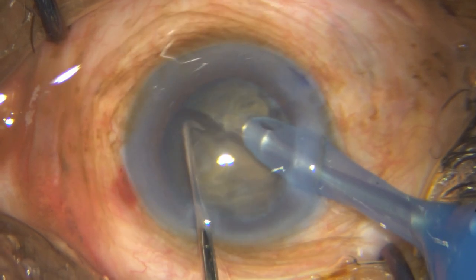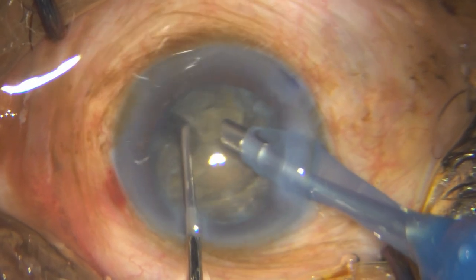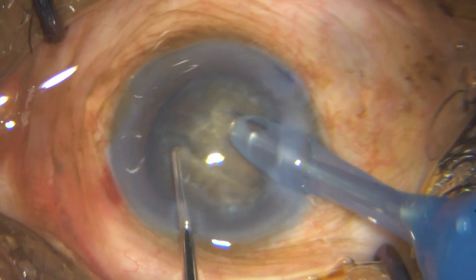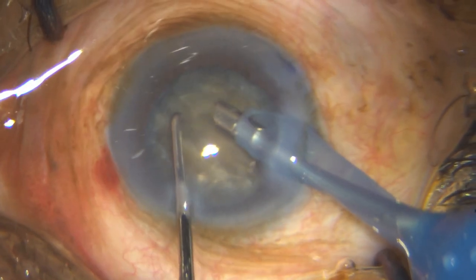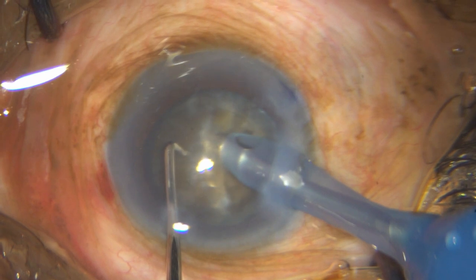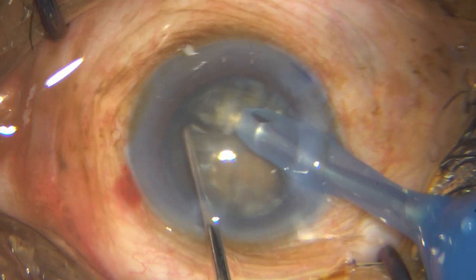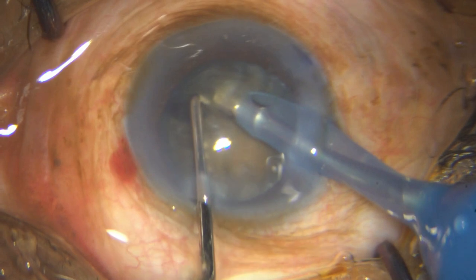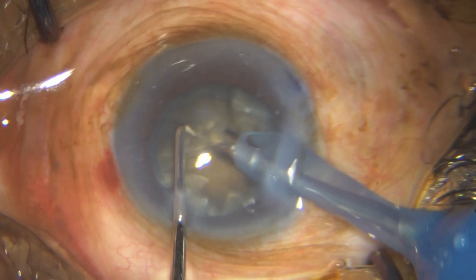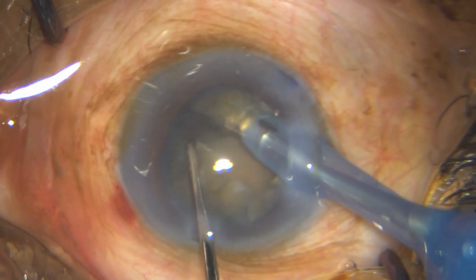You can see those attached fibers — you just need one or two fibers to be attached and that can really spoil a deal. The important thing is to be patient and do all the segments; do not try to remove anything in the beginning. A direct vertical chop does not work — you need the nucleus to be compact before you start removing segments, so you need to do all your chopping manoeuvres first, especially in hard cataracts.